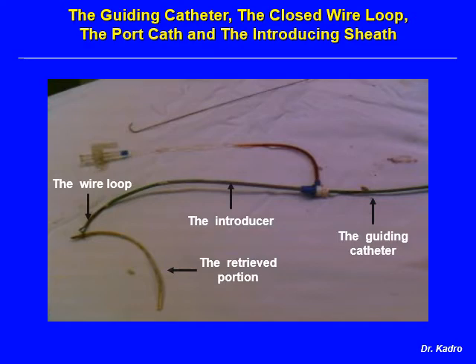The area of the right femoral vein was closed by manual compression, and the patient did well, and he was discharged the same day in the evening.